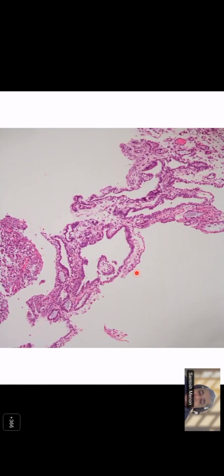What about this area? You don't see much signet. It is more of a cystic change, very cystic. And where are the nuclei placed? Hobnailing appearance. Hobnail. Very nice. Very good. So I think you have picked out all the findings. You find that there are some capillary-sized vessels and structures which look like vessels. There are tubules. There are these cystically dilated tubules which have got hobnailing cells. There is some myxoid mucinous material.